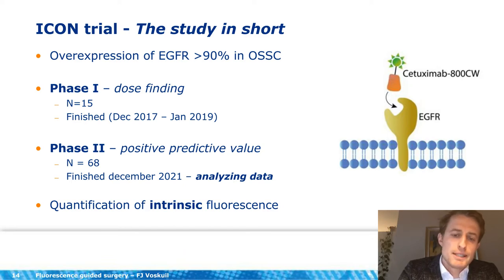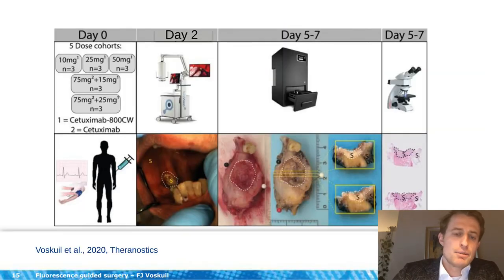And we performed quantification of the intrinsic fluorescence, because we believe that only looking at fluorescence might not be the best strategy, especially in dose finding studies. I will come back to that later.